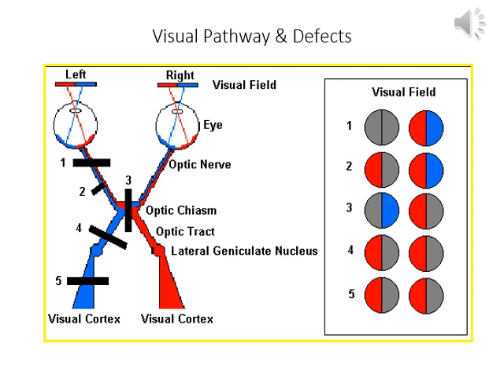And so finally, here we see a lesion at number 5, which is at the left optic radiations. And you'll note that number 4 and number 5 look very similar. So lesions at the optic tract and lesions at the optic radiations cannot be differentiated by looking at the pattern of the VEP results.